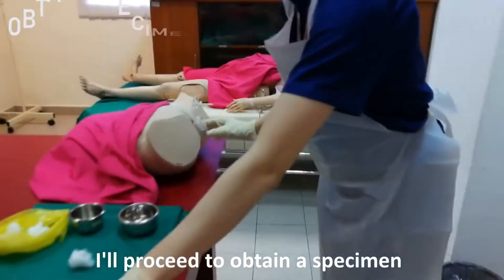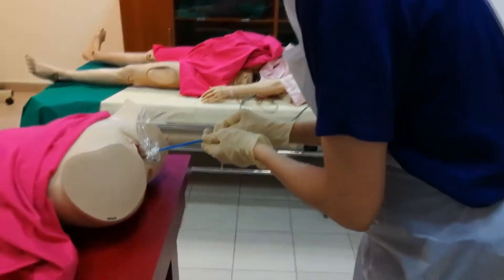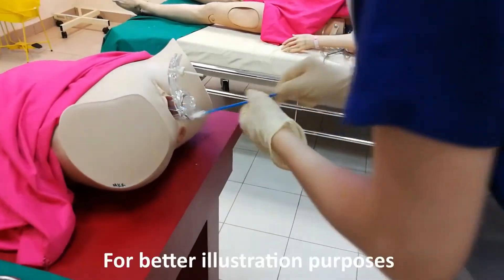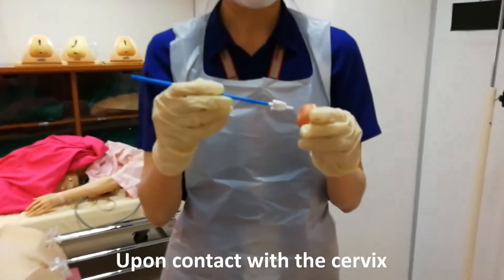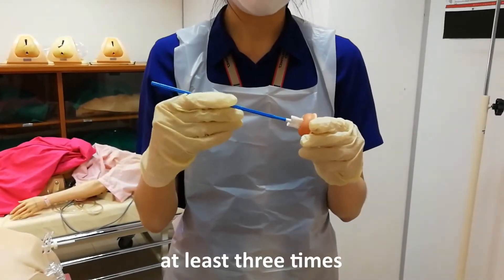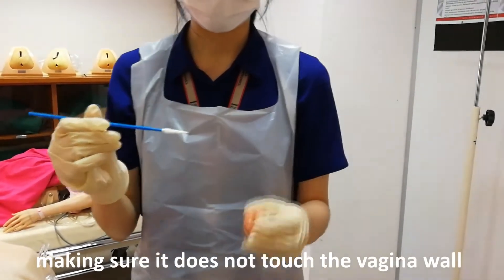After that, I'll proceed to obtain the specimen using the cytobrush, making sure that I do not touch the specimen on the vagina wall. For better illustration purposes, I'll demonstrate it on this sample here. Upon contact with the cervix, I'll turn the cytobrush 360 degrees at least three times and remove the cytobrush, making sure it does not touch the vagina wall or speculum.